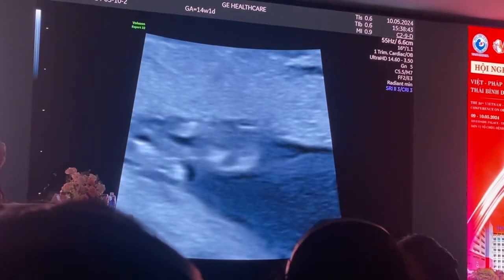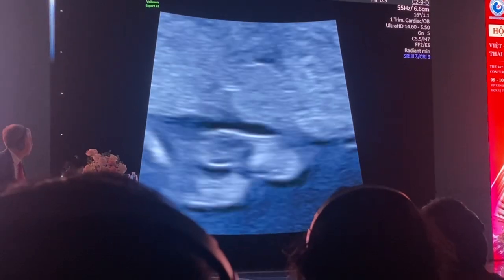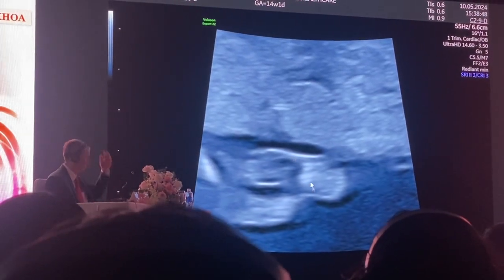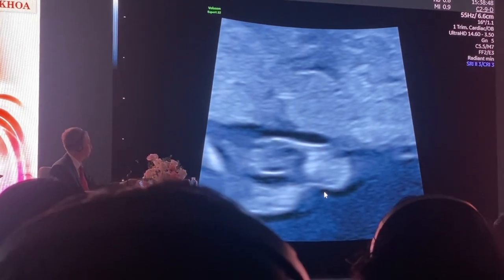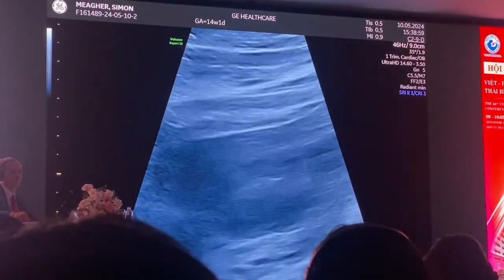rather than growth restriction, short bones. But unfortunately there's no chart for the first trimester. But still, I look at the feet. It's much harder counting the digits of the feet when compared to the digits of the hand. And you simply look to see whether the foot is wider than it should be, and that foot is not. And so that looks normal.